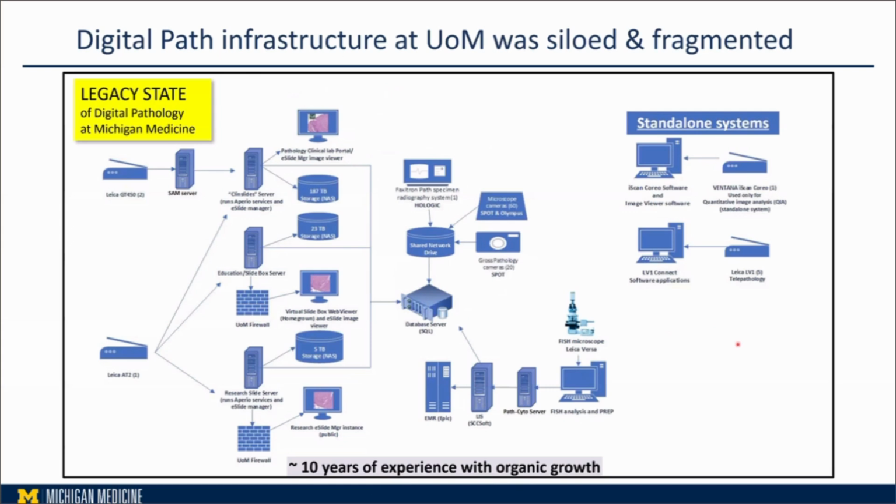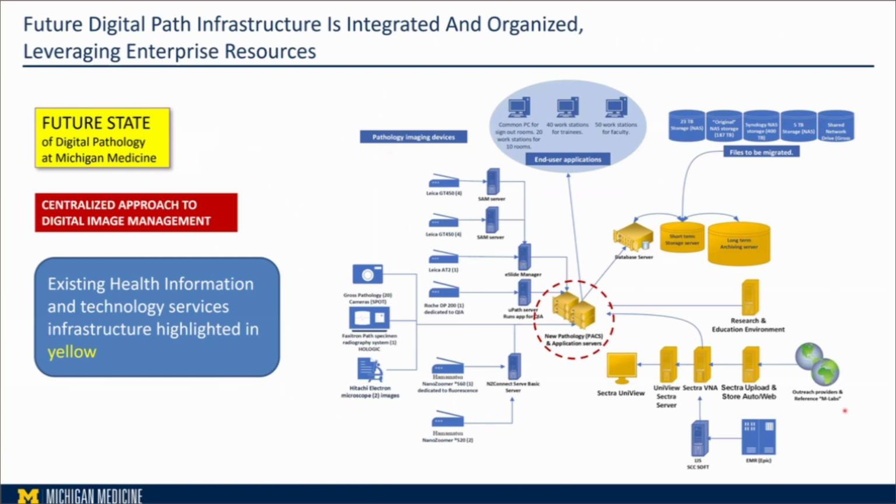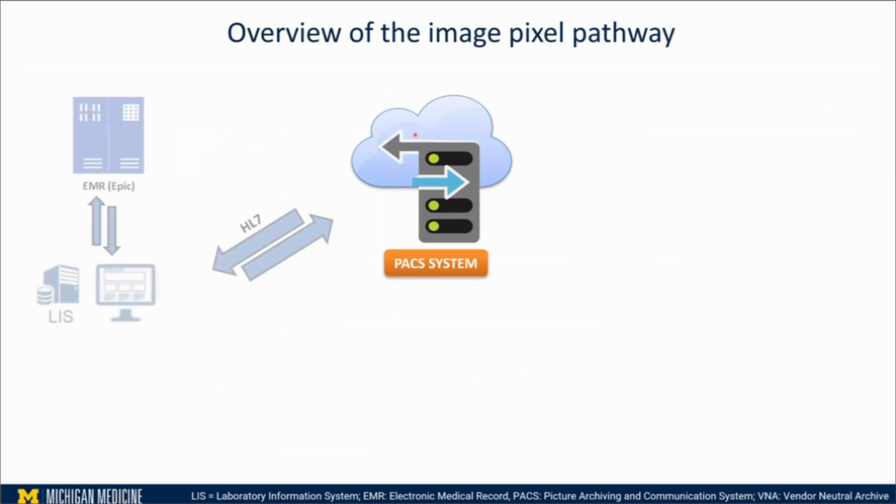The things also we put into account is the infrastructure. And this has helped us a lot, because we want to make sure what resources we have, how we can leverage our existing infrastructure to move into fully digital, and how we can build right now the future workflow. So from the PACS system, we make sure that we really need to interface with the lab information system.